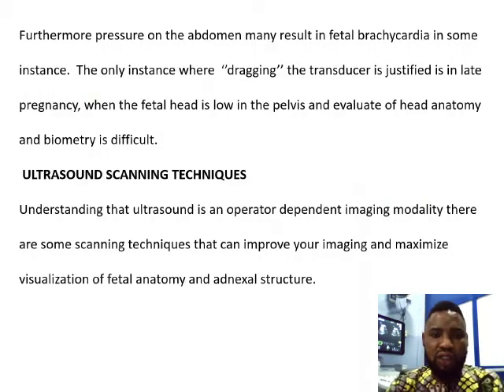Furthermore, pressure on the abdomen may result in fetal bradycardia in some instances. The only instance where dragging the transducer is justified is in late pregnancy, when the fetal head is low in the pelvis and evaluation of head anatomy and biometry is difficult.